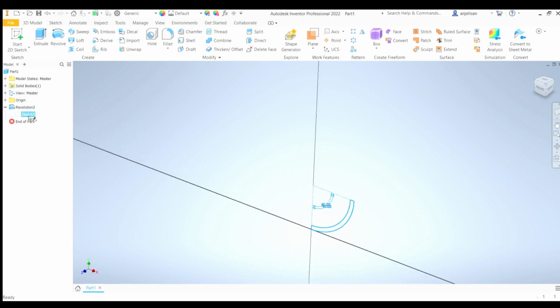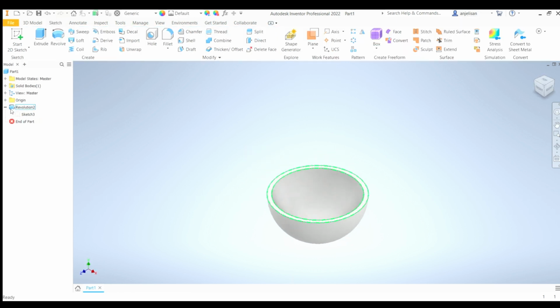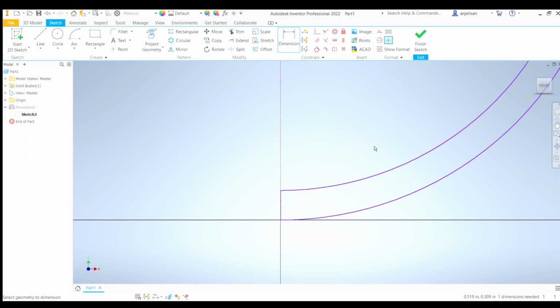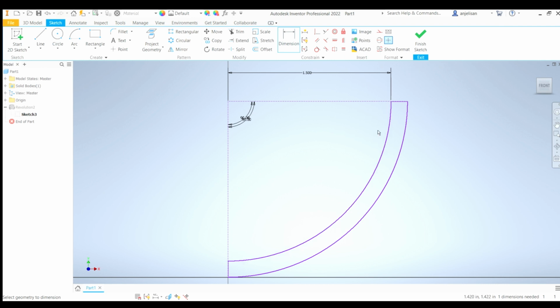So, sorry. Let's go back to our sketch that we revolved. The way you can do that, you can hit the plus button, and then you can double click on your sketch. Like I mentioned before, we know the diameter of the person's amputation to be 3 inches, right? So we can actually define this measurement, the radius of the cup. So we go from this point, the inner corner of the arcs, to this vertical dotted line here. What this does is measure the horizontal distance. And again, we know this measurement to be 1.5 because that's the radius, 3 divided by 2. You could also just type in the math here. And then again, just double click the mouse wheel. You can see now it adjusted everything accordingly to our radius.